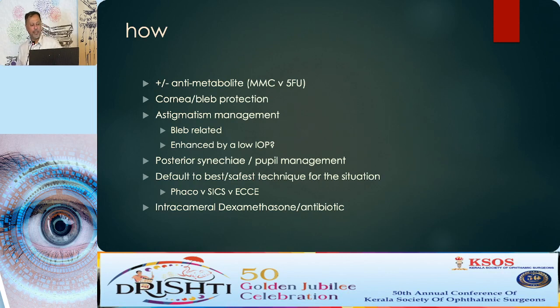And I've deliberately put phaco versus SICS versus ECCE here, because again, there are people here, I'm sure, who operate in different situations. You don't have to be embarrassed to do an ECCE or a SICS, because again, like I did say in the beginning, the most important thing is not to do a vitrectomy. Anything else, most glaucoma surgeons will be able to manage.